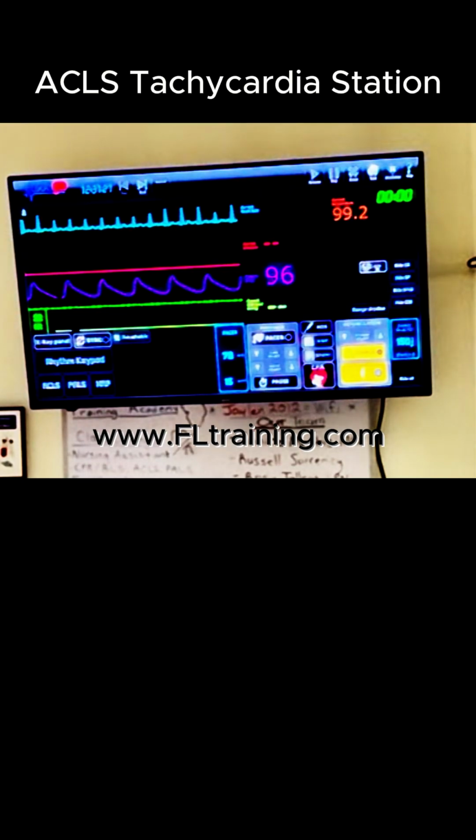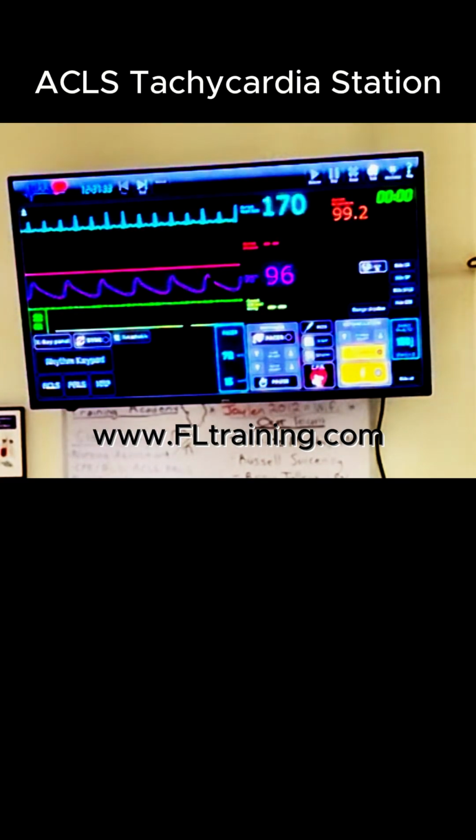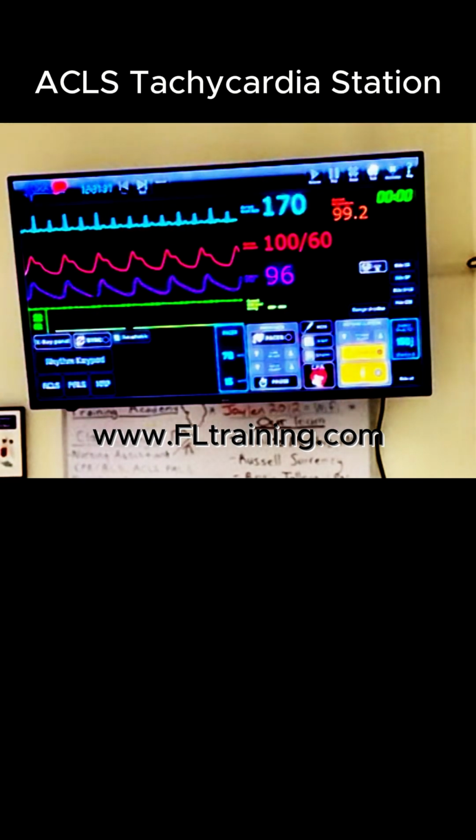You're in the patient's room. Vital signs are on the screen. Check the patient and tell her if she can do the vagal strain. Okay, so try to bear down. Bear down. All right, so vagal maneuvers attempted at 12:37, and they were ineffective.